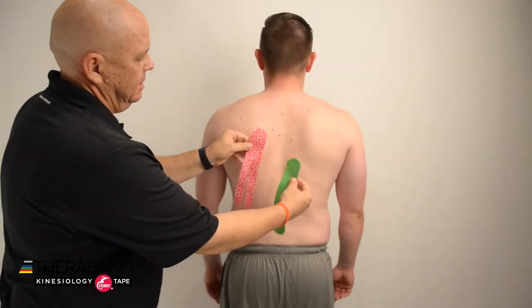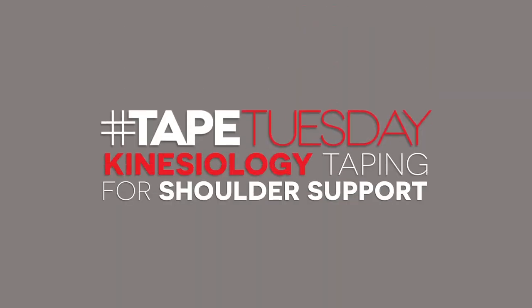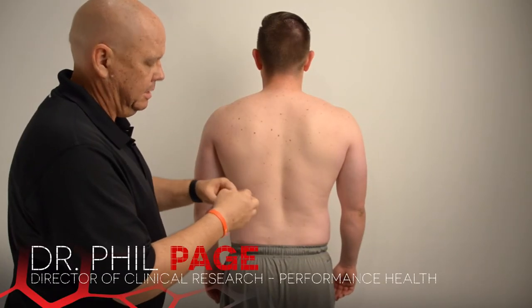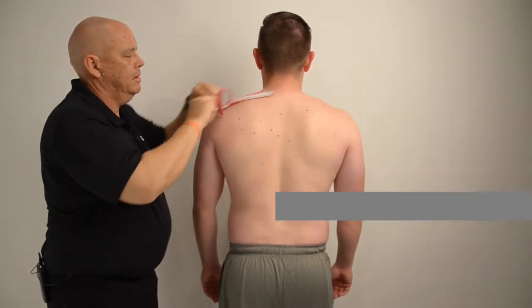For our shoulder support taping we're going to use two strips: one is going to be a long Y strip and the other an I strip. For the first strip, the Y strip, we'll remove four centimeters of the backing at one end for an anchor that we'll place right on top of the upper trapezius around the neck.